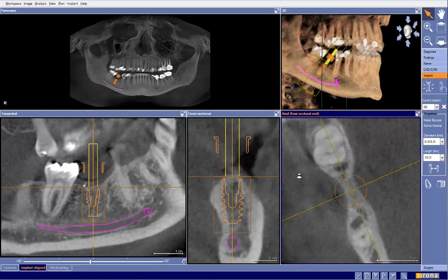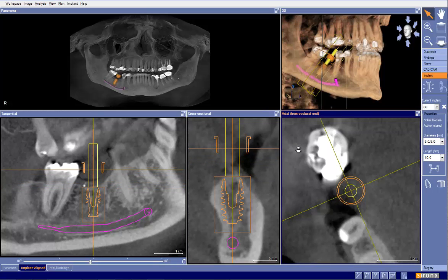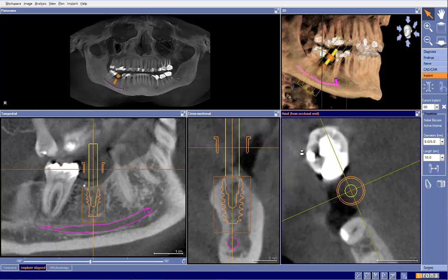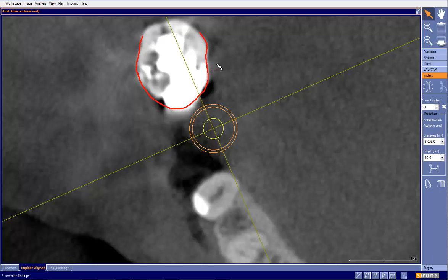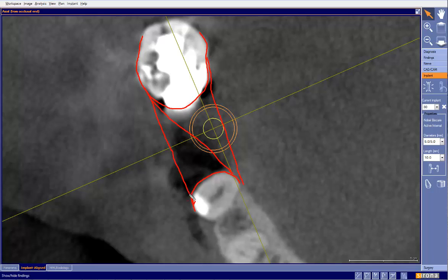After this we will take a look at our occlusal table, going to the axial view so that we see our adjacent teeth. I like to always look from this visual perspective. Based on this, this is where we want the head of the implant coming. So right now our plan is too lingual and slightly too distal. Hopefully that makes sense. And then the next thing that we'll look at is our occlusal plane.